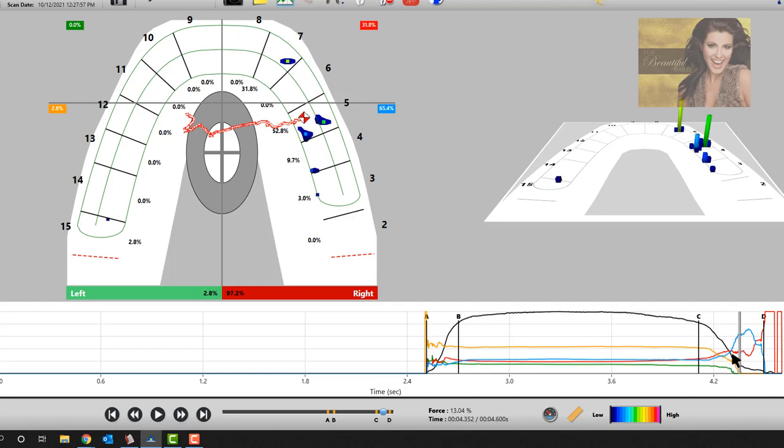But you have to be able to understand what T-scan is showing you before you can start making adjustments to teeth, right? And then once you do the correction, the decisions that you make become a lot easier. But it's like anything else. I can buy a sports car, but that doesn't make me a professional driver. It just means I wrote out a really big check.